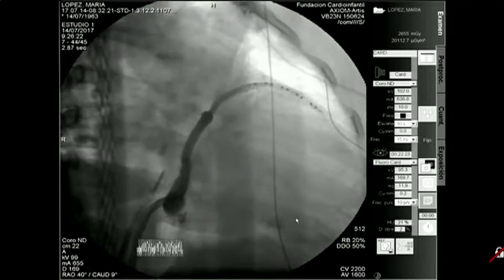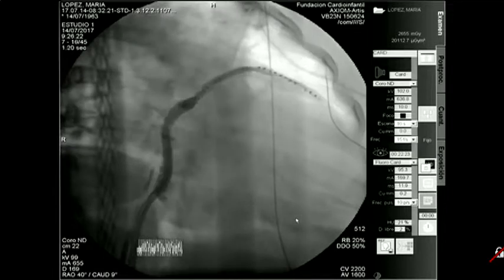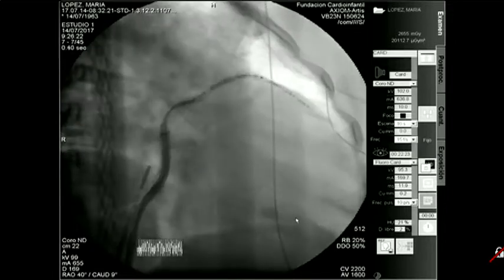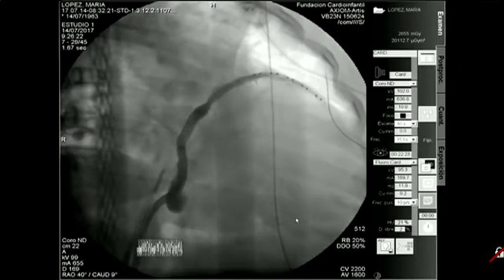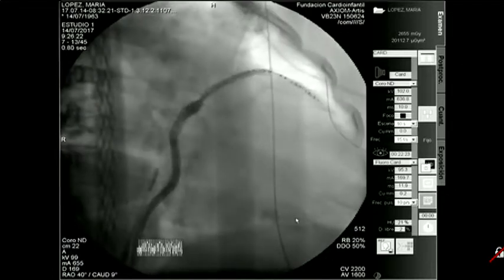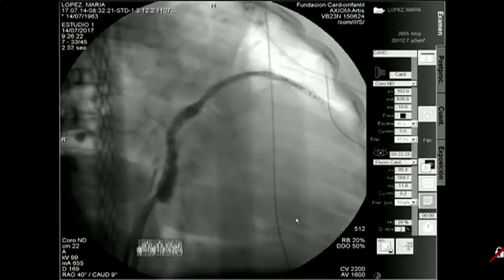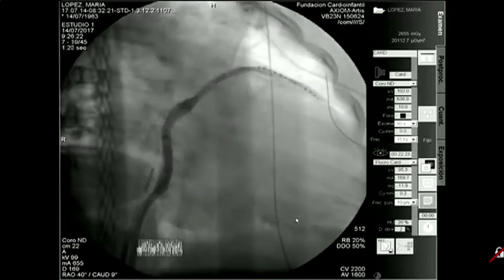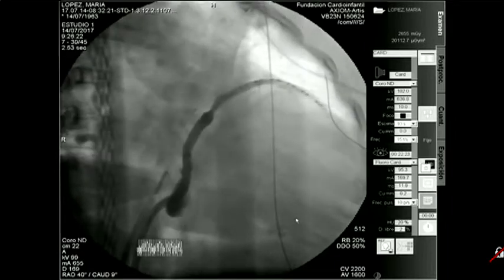Essentially, the vein is an epicardial structure, as Miguel said. The idea is to place this catheter on the vein to map the epicardial component of the ventricle, as we did yesterday with the vein of Marshall. This is the epicardial component of the top of the ventricle, in this case the LV summit.